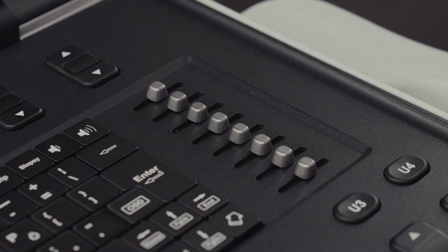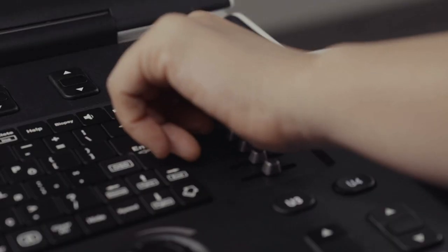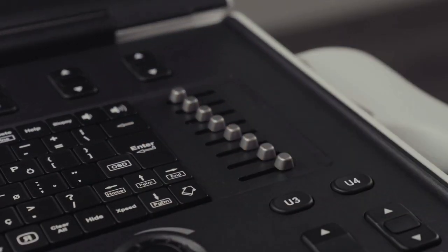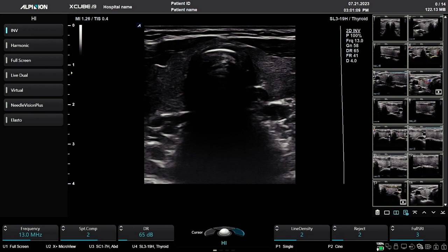TGC: the TGC slides are defaulted as a straight line in the middle. As you move to the middle position, you will feel a small click. This is center.